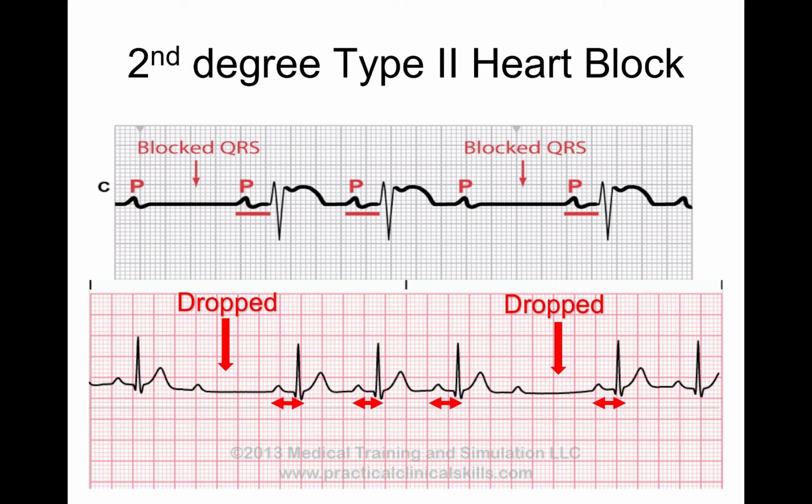You didn't get my signal for a minute? That's a little weird. So the P waves are firing and then there's no conduction. Like it didn't even go through. It's like when you use an ATM machine and it asks how much money you want to take out. You try to put in $1 million and it says okay, it's being processed, but you look and you're like, where's my $1 million coming out of the ATM machine?